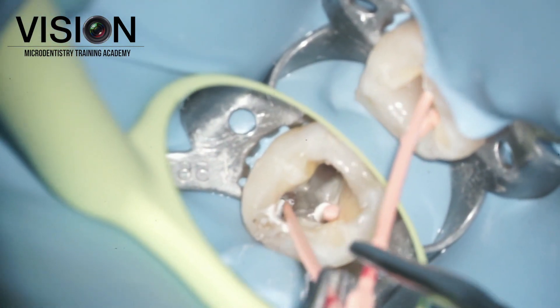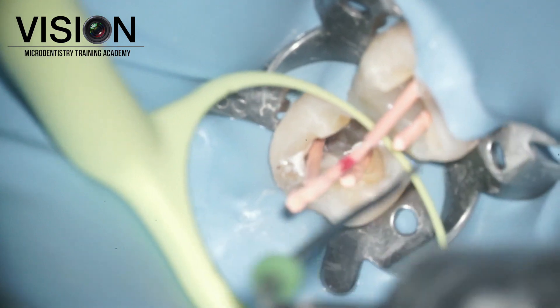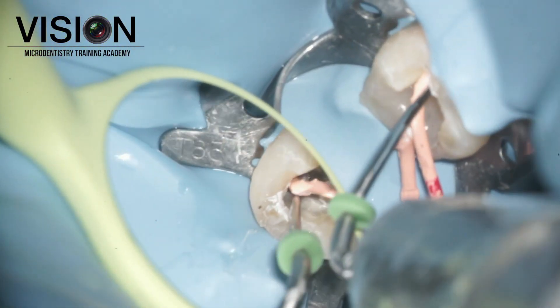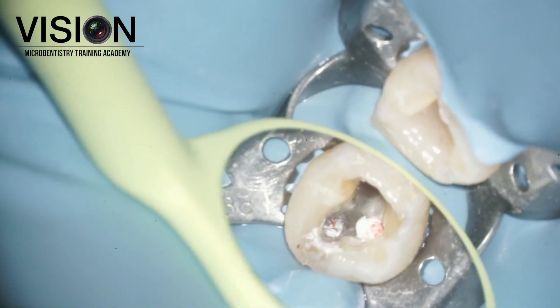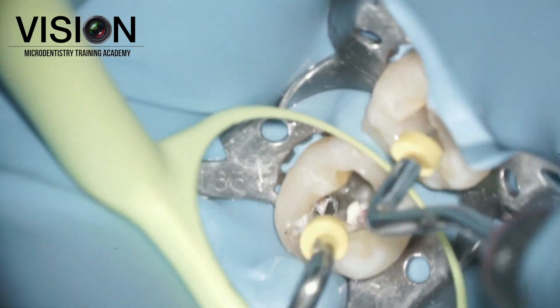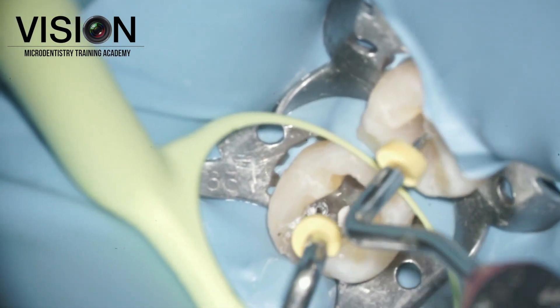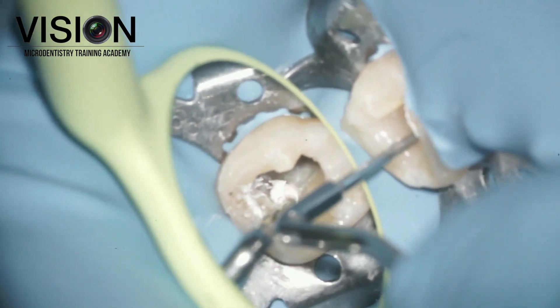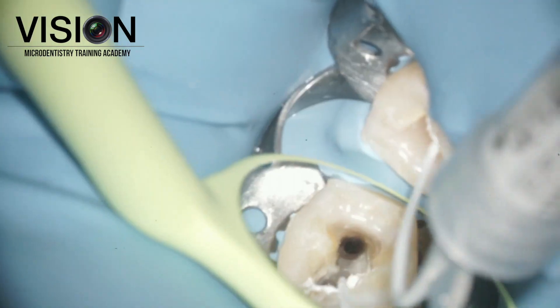There was one job accomplished — retrieving the instrument and doing the obturation — but we also had one more task: to seal the perforation created by the previous dentist in the attempt to retrieve the instrument. Once we filled the mesial canals, one of the canals where the instrument had separated, we did a down pack just above the level of the perforation.